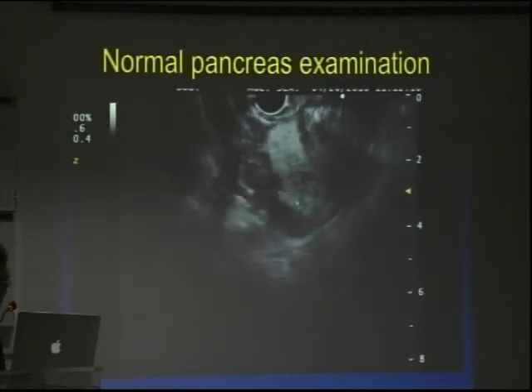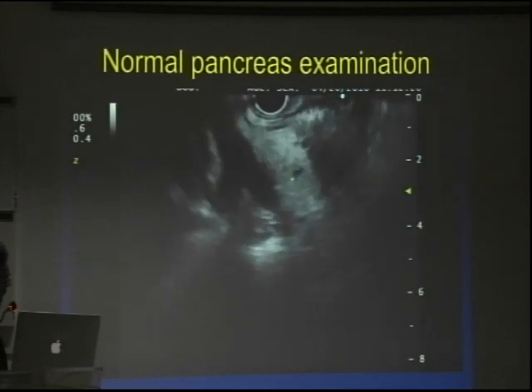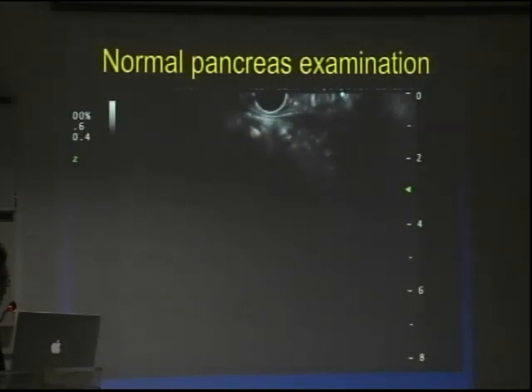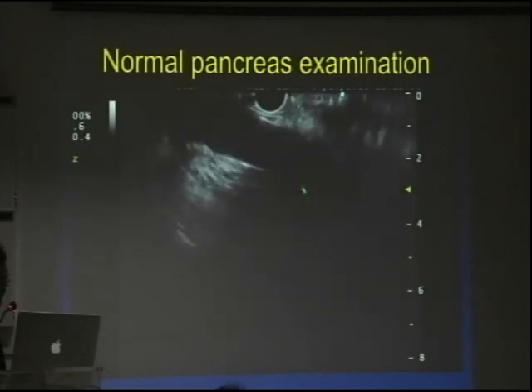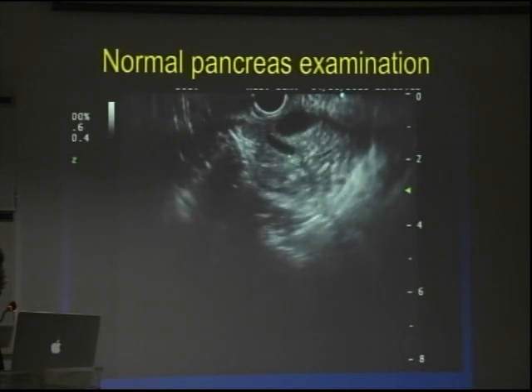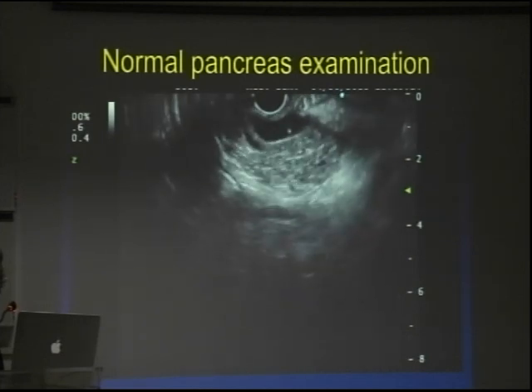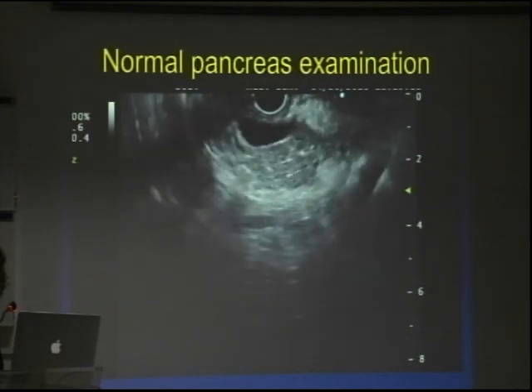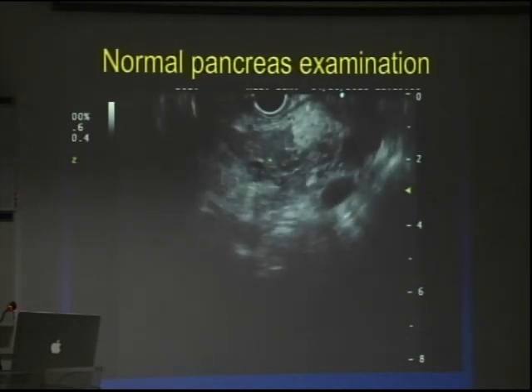So that's the ampulla itself. Now going back to the second part of the duodenum. Those 5 structures I was mentioning: aorta, bile duct, then pancreatic duct. From here, you can pretty much do the whole pancreatic exam in one pull through.